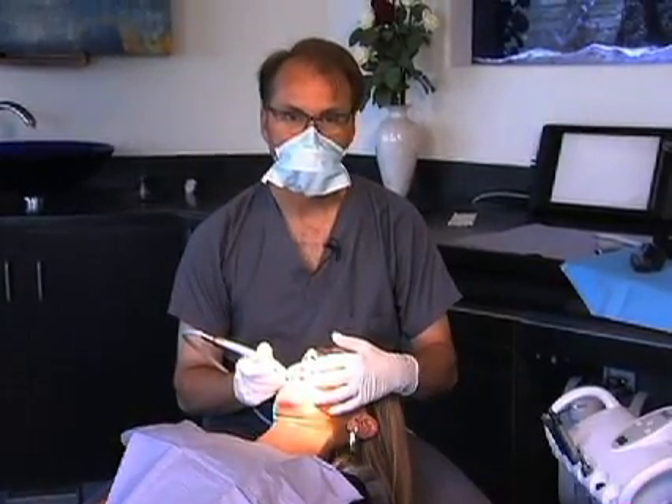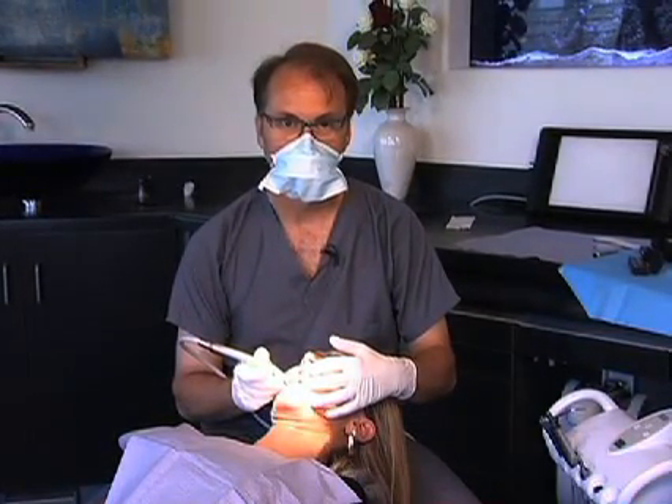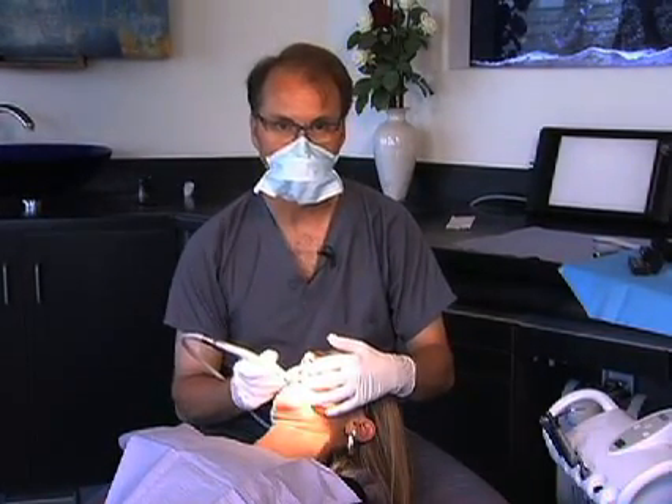Now I'm going to begin prepping the upper right central incisor with the same sequence used before, starting with the incisal depth cut.